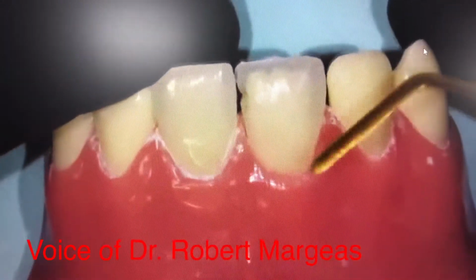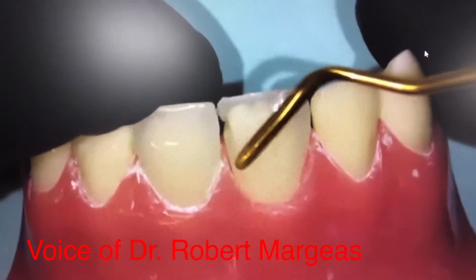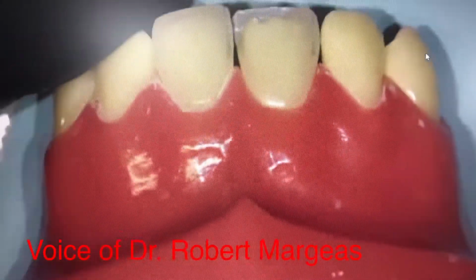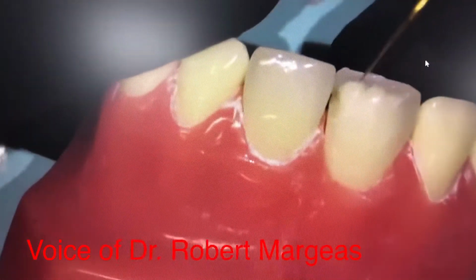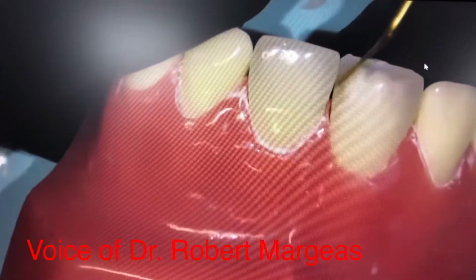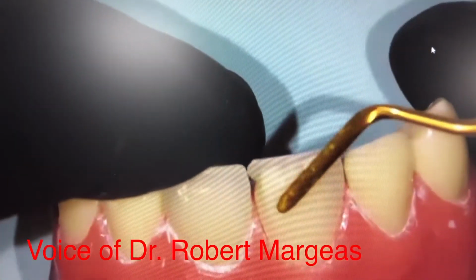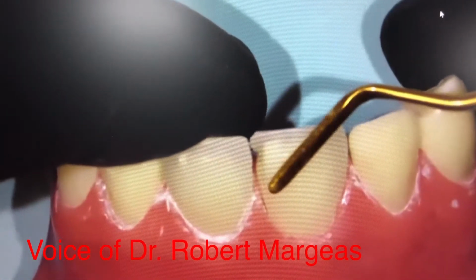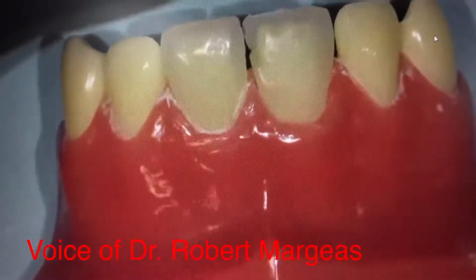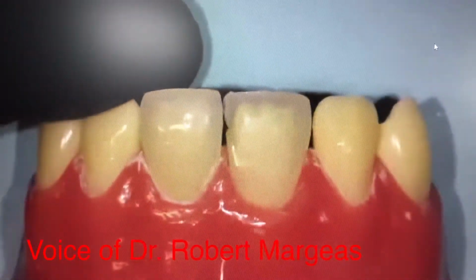And it's also critical to be able to have a material that can blend in. I would say Filtek Supreme dentin shades are very, very nice. There's a new one from Ivoclar called Tetric Prime. Very, very nice colors. There are a lot of them on the market that can work well, as long as the material does not slump. And I want to have room for my enamel layer.